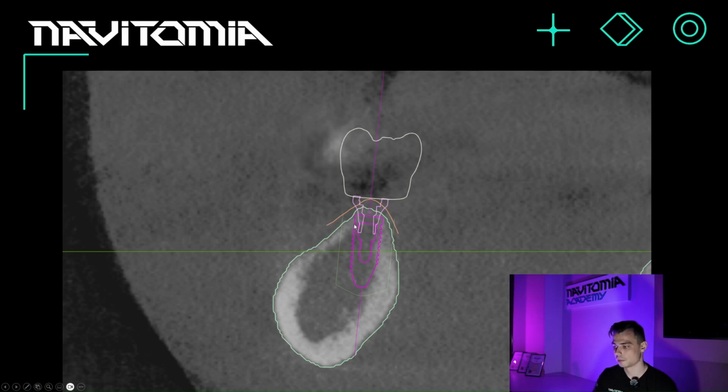The first issue is that the cervical area of the implant, as you can see, comes into contact with the cortical layer. If you watch the video I mentioned, the one about the cortical layer, you'll notice and can note for yourself that the blood supply to the cortical layer is not as good as that of the spongy bone. And most often it is with this positioning of implants that cervical resorption occurs. In other words, this is the process in which the bone recedes, you could say. That is, it undergoes lysis, it resorbs around the implant, around the neck of the implant, and this is a long-term postoperative complication that needs to be addressed. If nothing is done about this, then the implant may eventually be lost. In other words, it will disintegrate. This is the first issue, which is especially problematic and concerning, and which in fact directly results from this particular kind of implant positioning, as you can see.